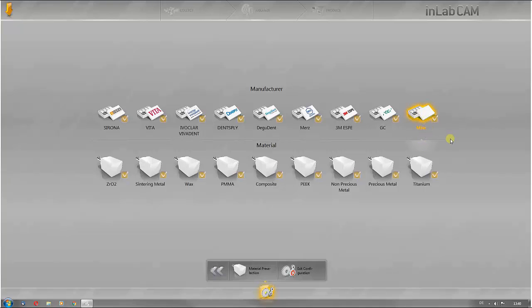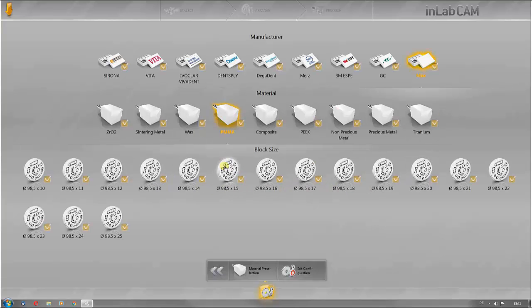Unlike the manufacturer categories, the individual material groups are shown here and can be selected. You can also select the blank or block sizes individually.